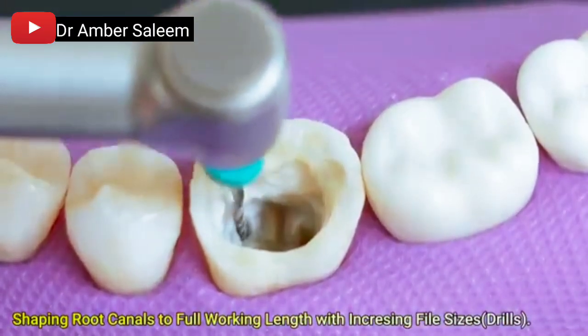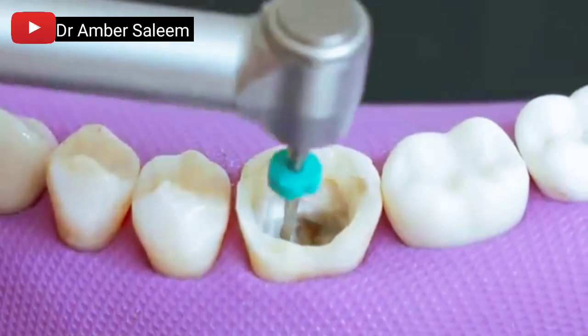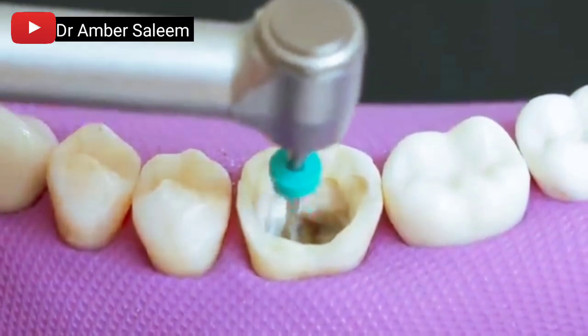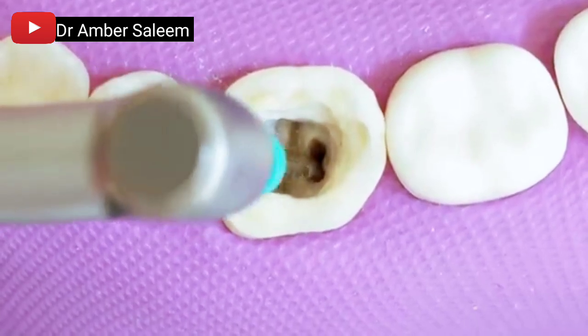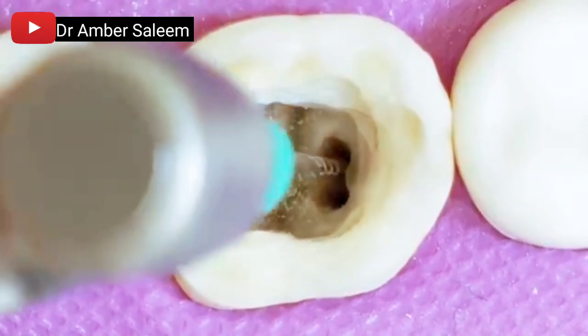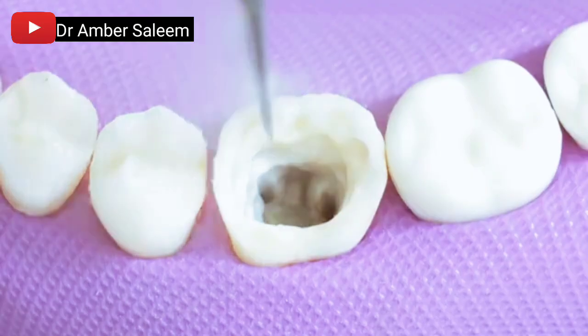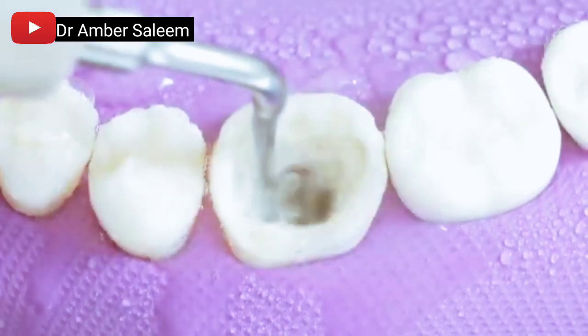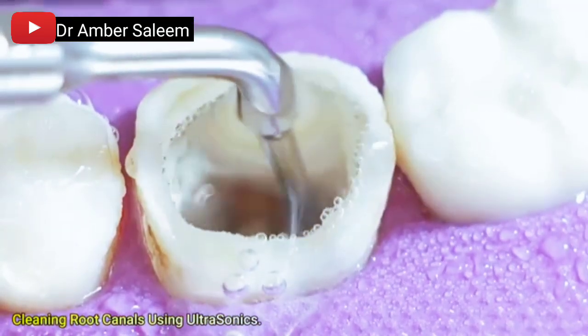Shaping root canals to full working length with increasing file sizes. Root canals are then cleaned using ultrasonic instrumentation to remove remaining debris and irrigant.